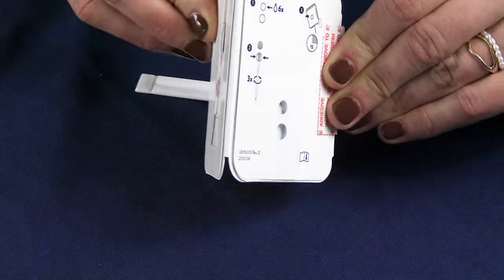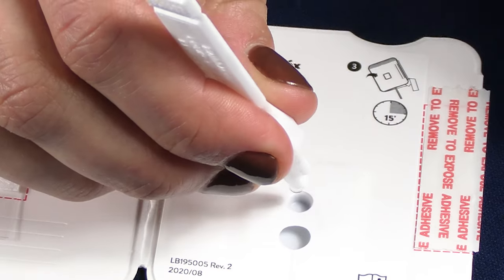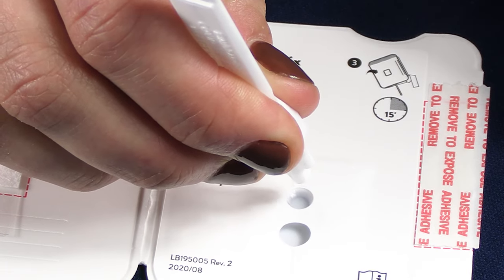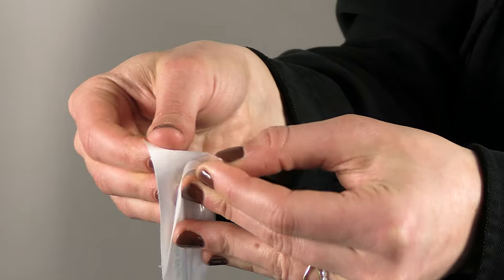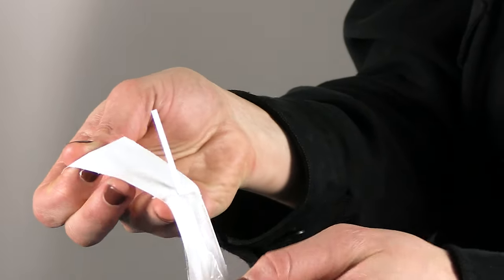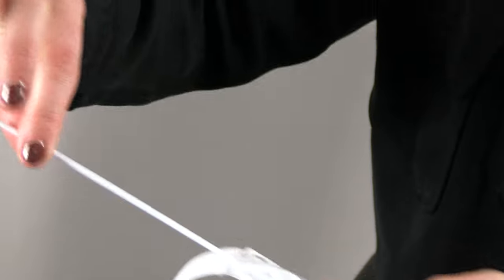Open the test card and lay flat for the entire test. Apply six drops of the extraction reagent to the first hole. Open the swab package at the stick end. Be sure not to touch the top cotton part of the swab.